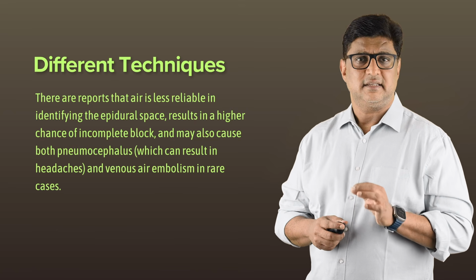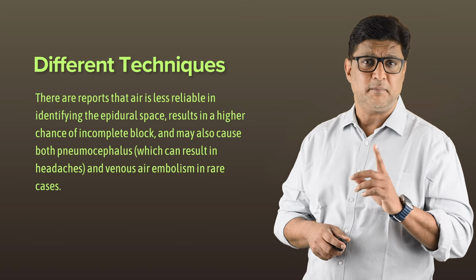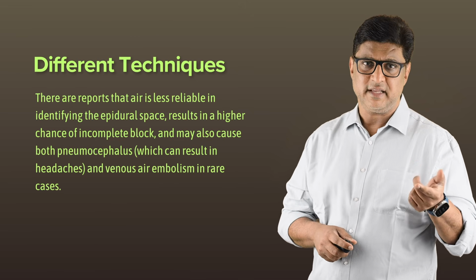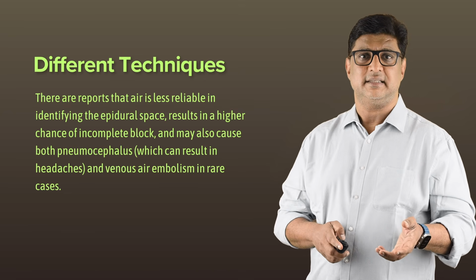The studies suggest that air is less reliable for locating the epidural space. It is linked with a higher incidence of incomplete blocks, risk of pneumocephalus, which can lead to headaches, and in very rare cases, venous air embolism is also seen.